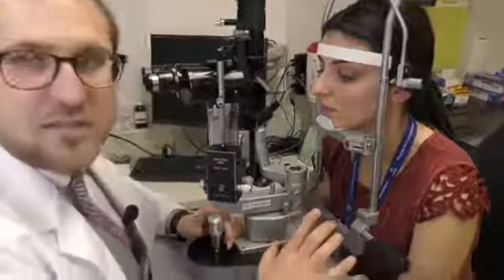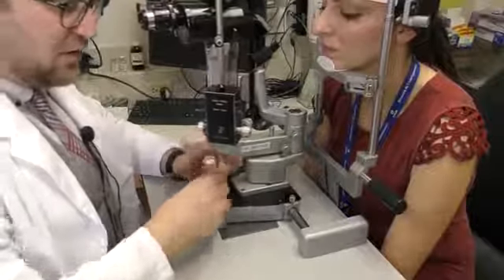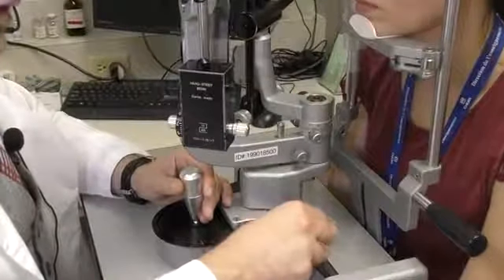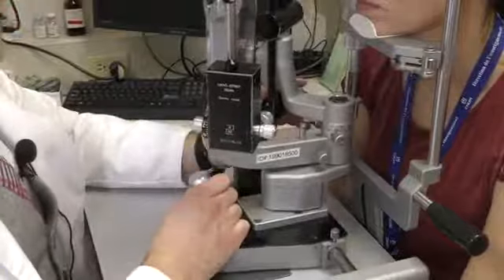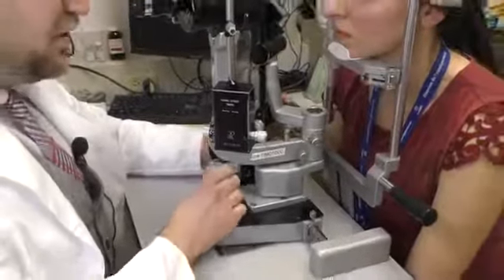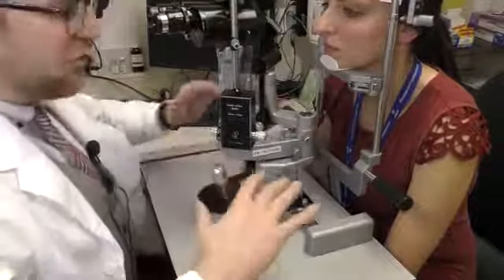So what I want to do next is unlock the machine. The machine, as you know now, is locked for safety reasons. You don't want the machine to fly forward and hit the patient. So what I do is I turn the knob here counterclockwise. Okay, so as we turn it counterclockwise now, the machine is free. Now the machine moves in different axes. It moves forward, backwards, left and right, so X, Y axis. And you can also rotate it a little bit as well, like this in the Z axis. So you have that nice freedom of movement.